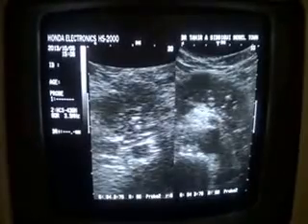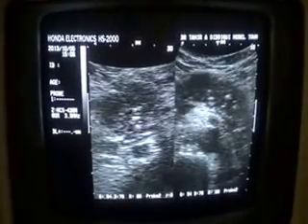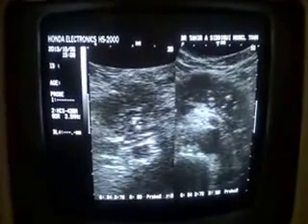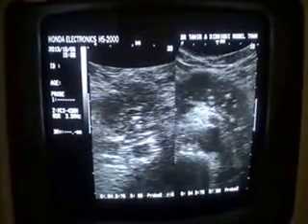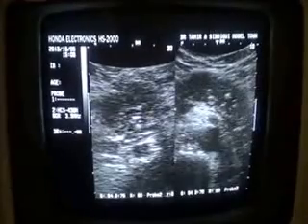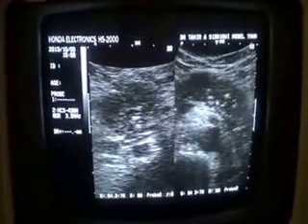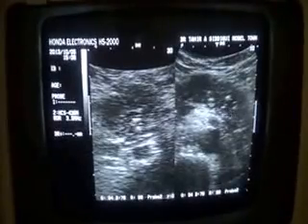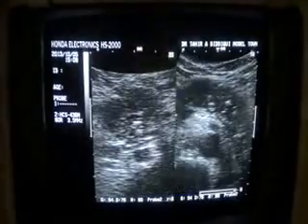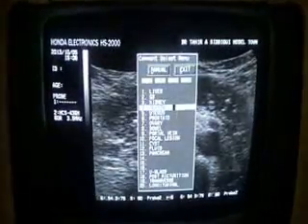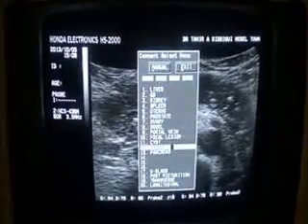Now once again a small review: this is a longitudinal section of the head of the pancreas, this is the pancreatic duct and this is a tiny echogenic area. The second structure is the superior mesenteric vein, this is the splenic vein, so this area we are seeing is the pancreas. These are very small tiny calculi visible in the body of the pancreas. This is the superior mesenteric artery, this is the aorta in transverse section. We do see multiple echogenic particles within the whole substance of the pancreas.